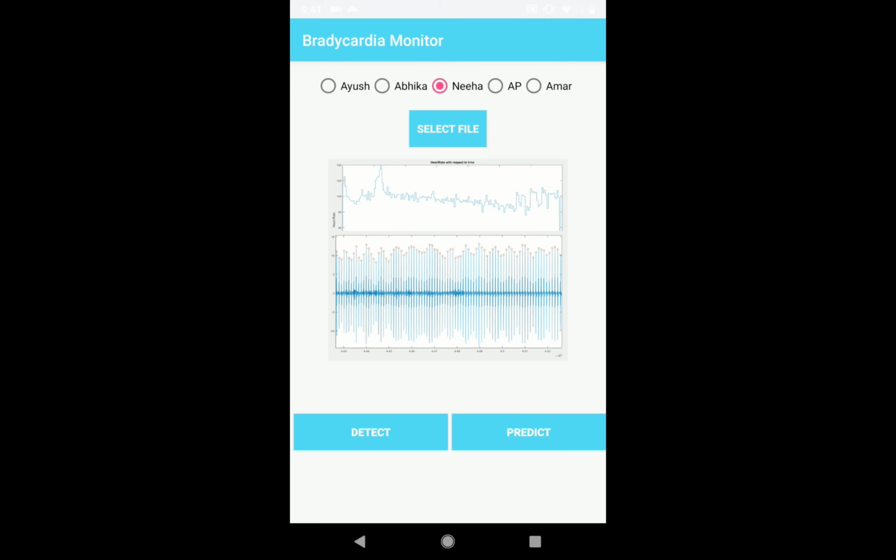We calculated the cumulative density curve by estimating the sum of all the normalized mean and variance values as a function of distance from the k-means clustering centroid. The density collection of normalized mean and variance will be given by the steep inclinations of the heart rate curves which we obtained.